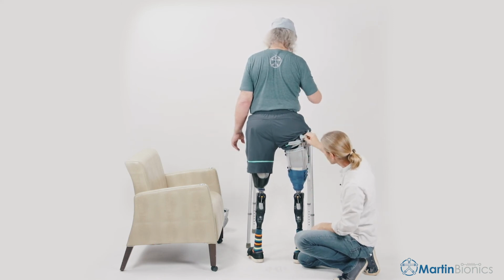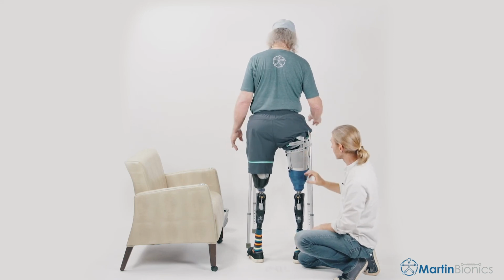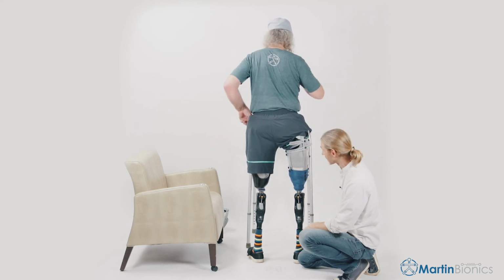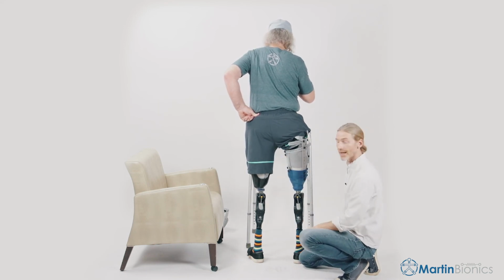This looks pretty good. Maybe it could come on just a little bit tighter. All of the cross connectors are snug in the right positions. If we need to adjust something, it's a thumb screw, take it off, slide it where we need to. Now, this actually looks great out of the box right as we set it up. I don't really think we need to make any adjustments here anywhere on the socket. I think it looks fantastic.